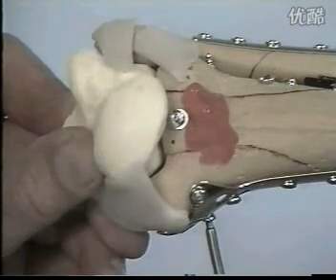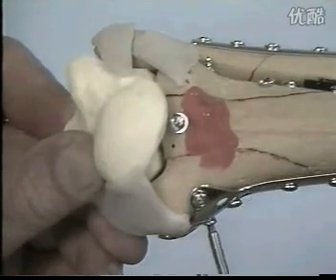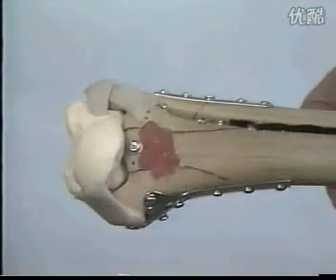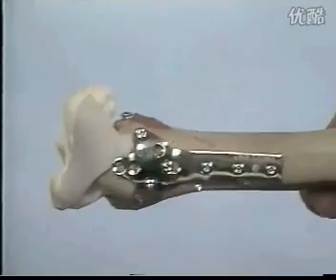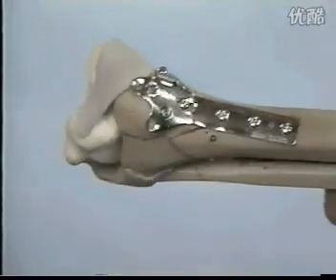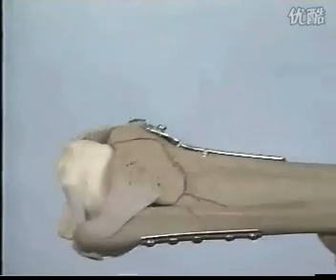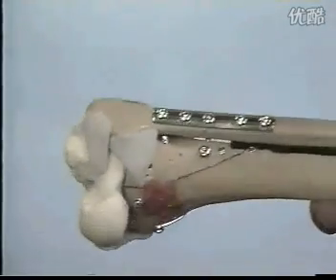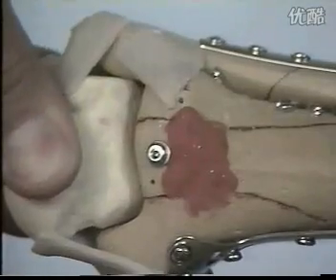The 4 operating steps may be recalled. First, fibular reconstruction with definition of length. Second, reduction of the tibial, especially the joint fragments, and stabilization with screws. Third, medial support by a buttress plate. And fourth, cancellous bone graft. The joint surface of the tibia is anatomically reconstructed.